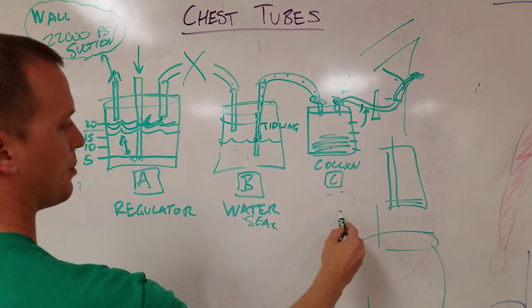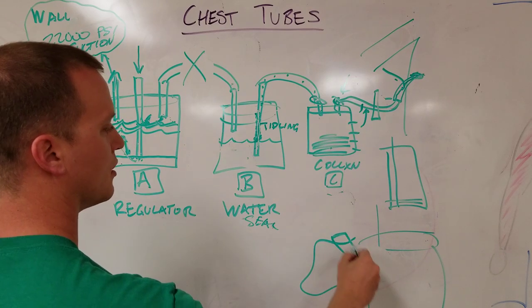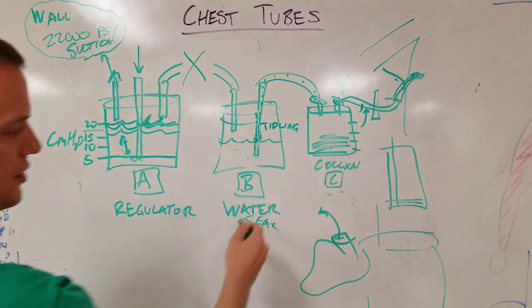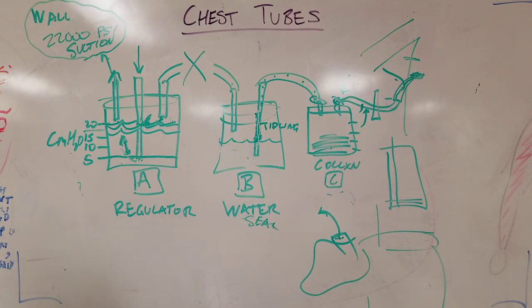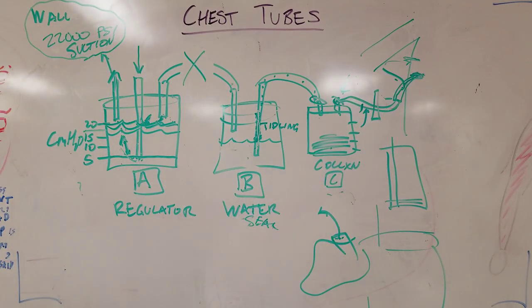Let's say that inside the patient's chest, you did a pulmonary resection and the stapled bronchus is leaking air. Air could leak out into the chest, which would then leak through your system. Let's say that your patient had a hole in their chest from a gunshot wound that you didn't suture close or staple close or treat or whatever. Air could come in through there. So basically, if you have an air leak, that means that at some point in this system, whether inside the patient's chest or outside of it, air is getting in your system that you don't want to be there, okay? Those are really the big things to go over.